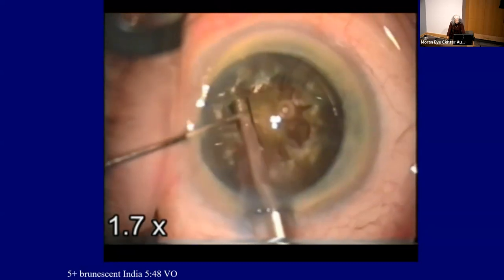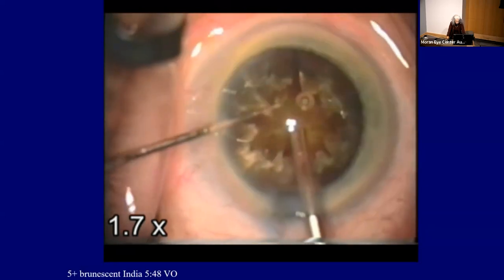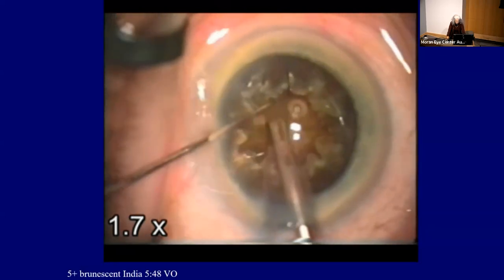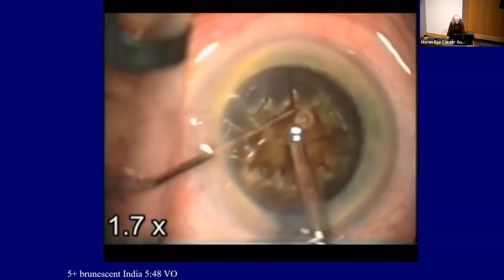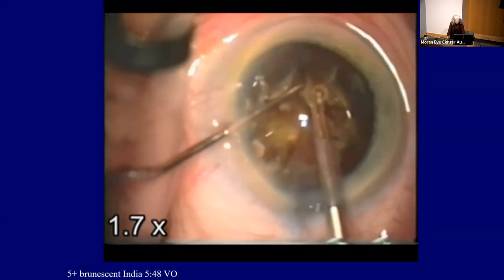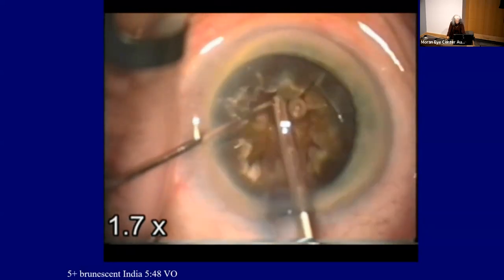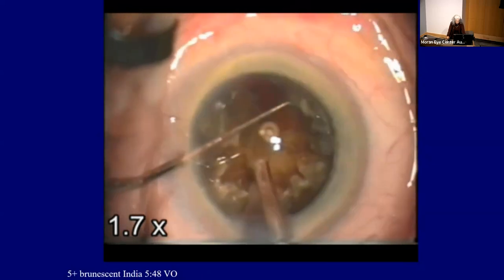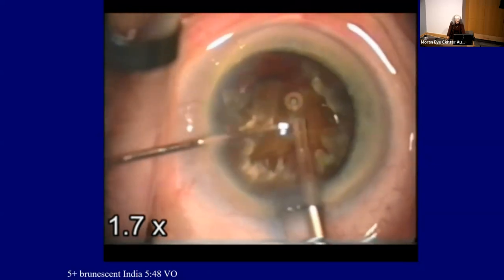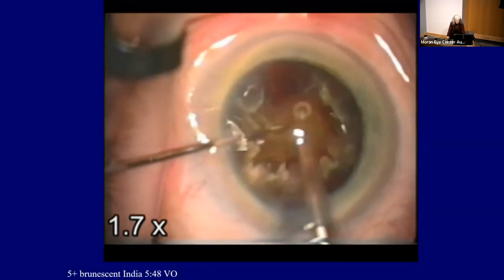I always go into foot position zero into an OVD-filled situation. And of course, you always have to recognize that you must establish flow absolutely before you ever go into ultrasound when there's OVD in your environment, to prevent a burn. So you can see now we're being pretty uniform. And the whole trick is to just be patient and to just uniformly thin this lens.